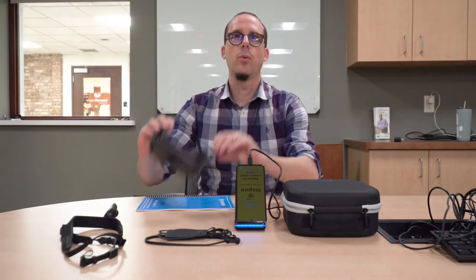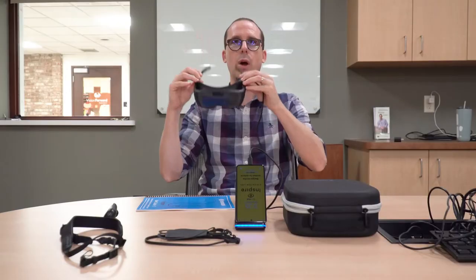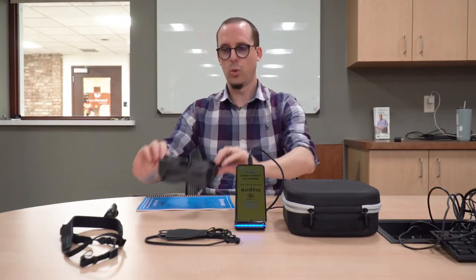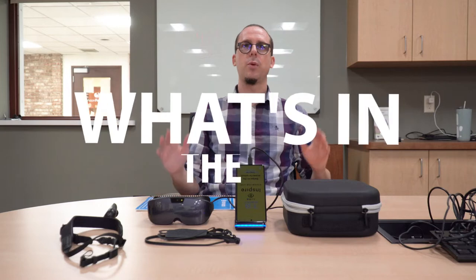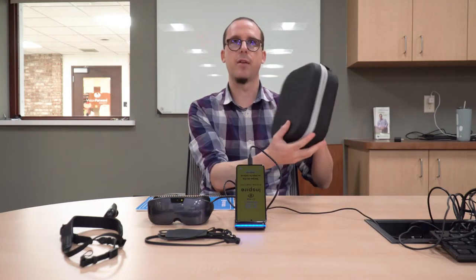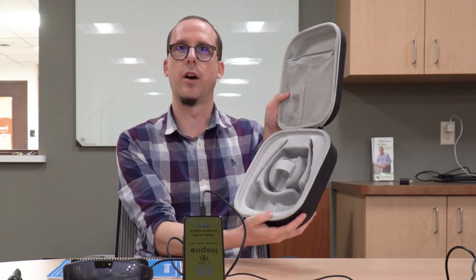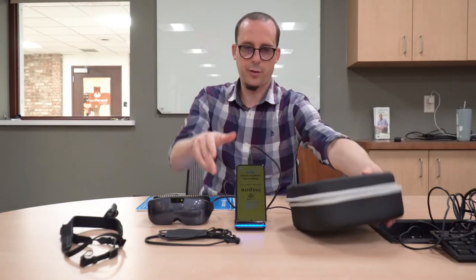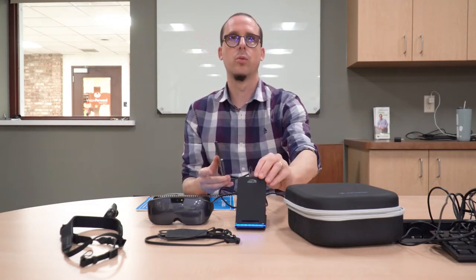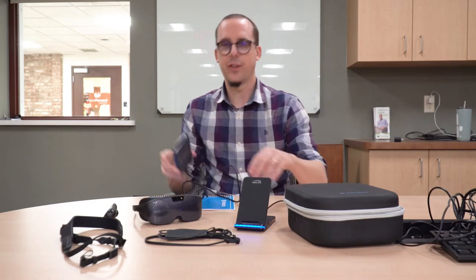Here we have the IrisVision Inspire - a new wearable with a number of cool features and a very cool design. What do we get in the box when we get an IrisVision Inspire? We get a very nice carry case for our device and all of our accessories. We get this rather nice wireless charging dock.